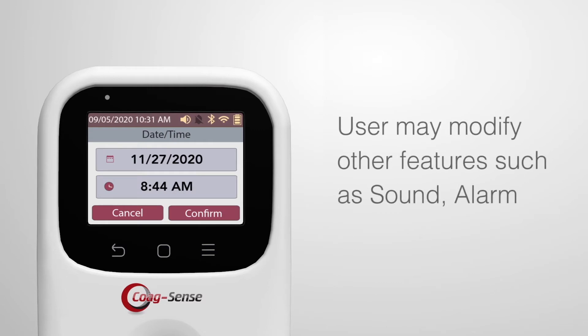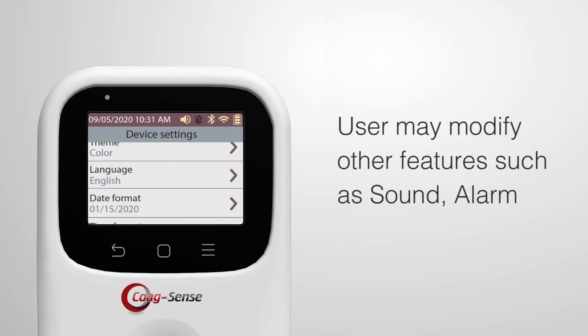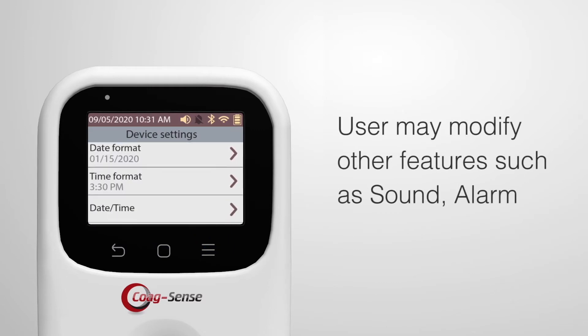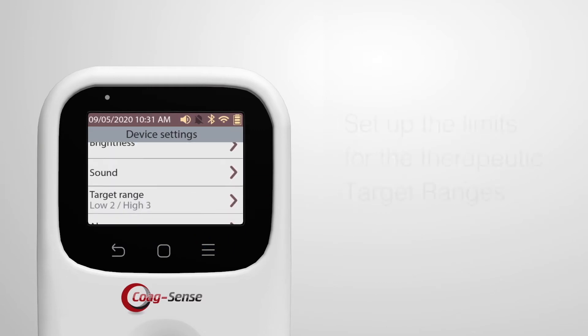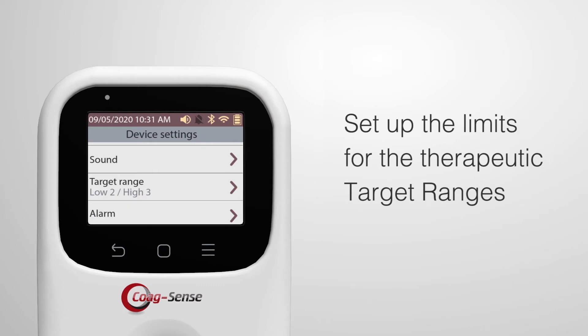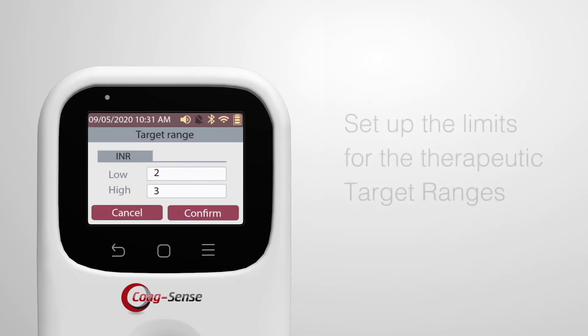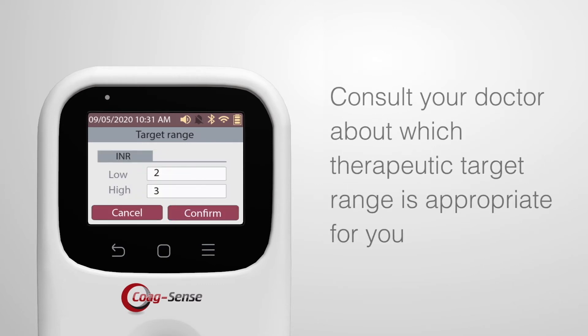User may modify other features, such as sound, alarm, and set up the limits for the therapeutic target ranges. Please consult your doctor about which therapeutic target range is appropriate for you.